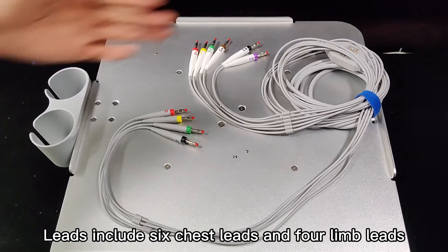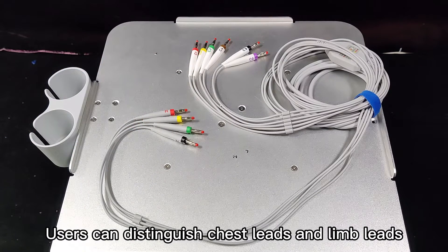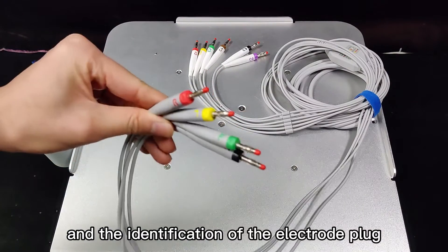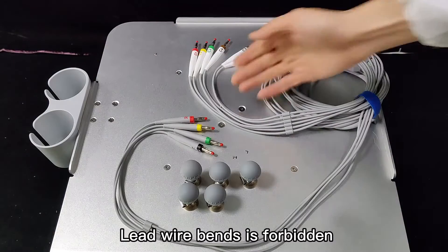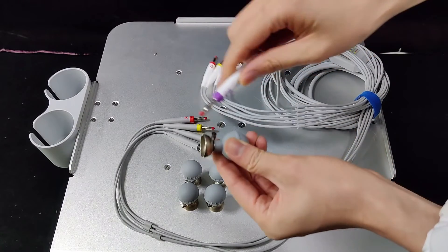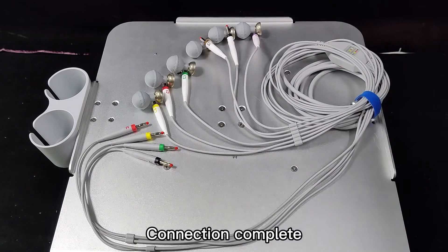Leads include 6 chest leads and 4 limb leads. Users can distinguish chest leads and limb leads by the color of the lead wire and the identification of the electrode plug. Connect the electrode plug to the electrode socket. Connection complete.